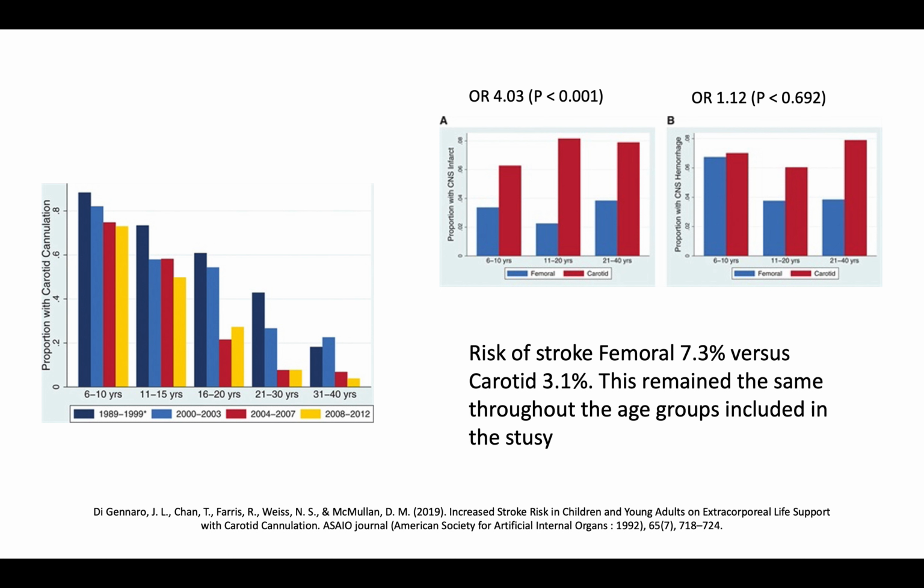The study did not look into limb ischemia, which is a common complication of femoral cannulation. Clinicians require this information to decide on the risk benefits of different cannulation sites. Maybe someone is already looking into it. Fingers crossed. In summary, which strategy for cannulation offers the best outcome in children requiring VA ECMO is unclear at present. Neck cannulation is a viable option throughout the pediatric age group.